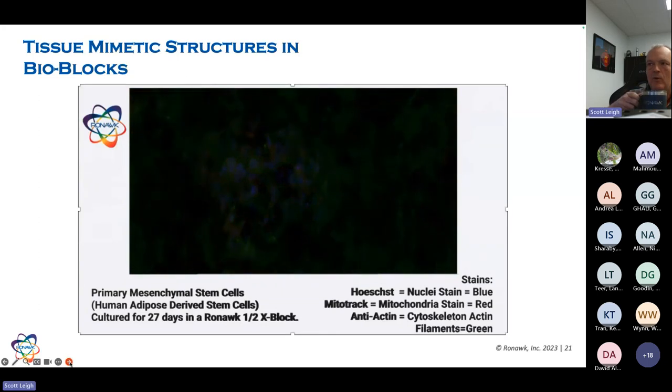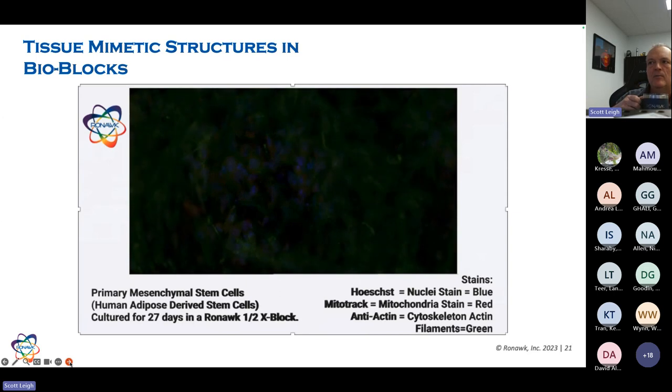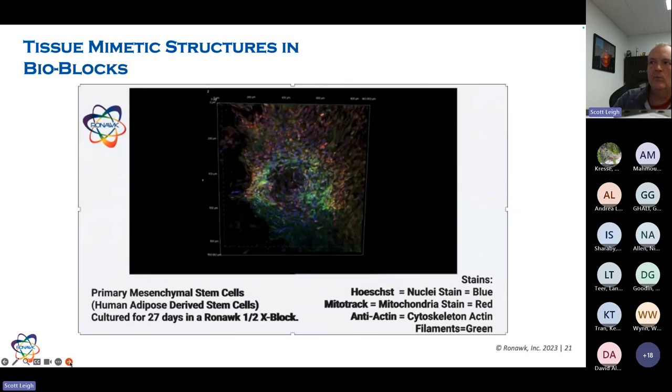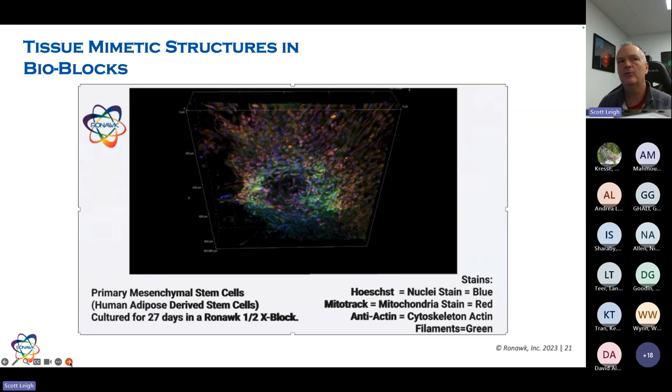And now we're going into the pore, again, about 100 microns, 150 microns, and now we come back out and we see that cell organization. I did mention that we're able to section the blocks. When we section them, we see this throughout the blocks.